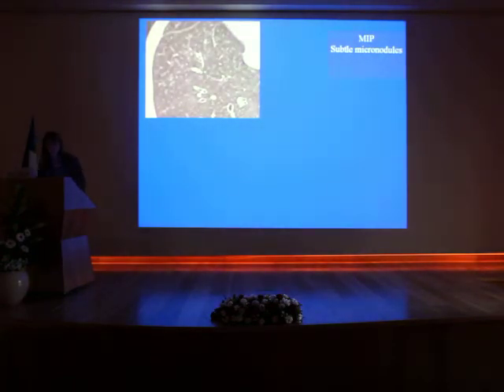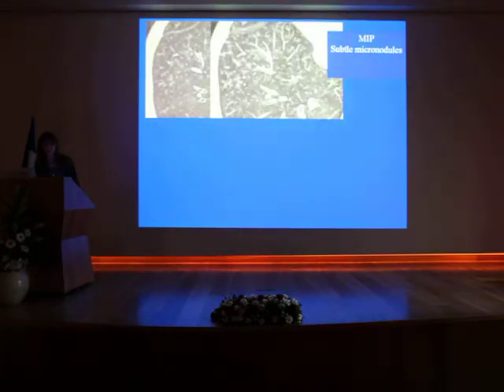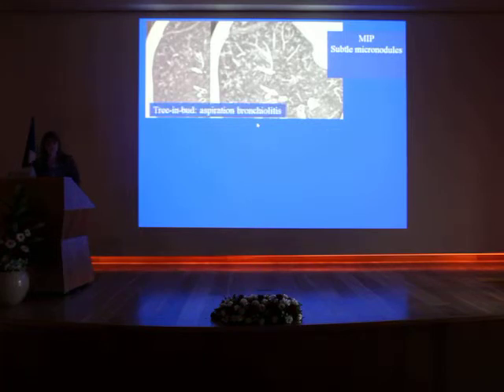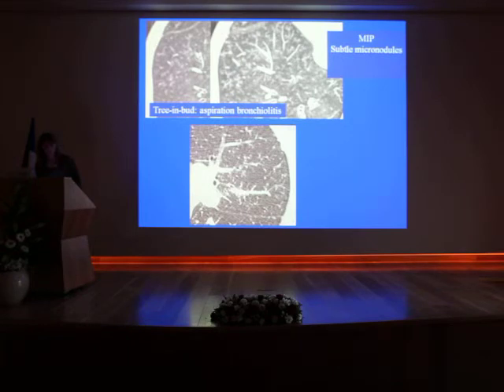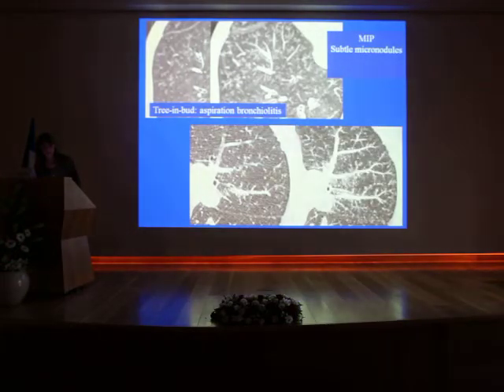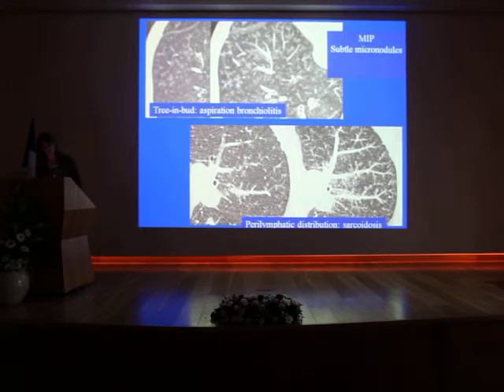Maximum intensity projection is helpful to detect subtle micronodules. You may suspect there are some micronodules here, but they are much better seen with MIP. This is a tree-in-bud pattern, meaning the small airways are inflamed — in this case, aspiration bronchiolitis in a patient who had previous laryngeal cancer. And here you have an abnormal appearance of the vessels with nodules along the vessels in a lymphatic distribution, better seen with MIP reconstruction — consistent with lymphatic distribution in sarcoidosis.